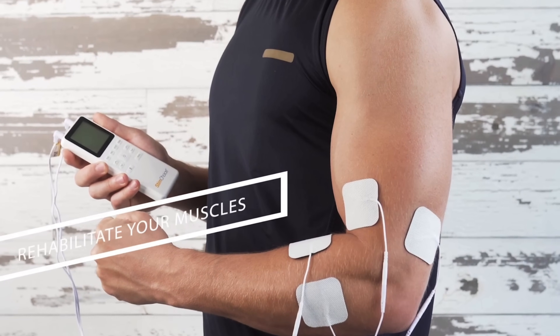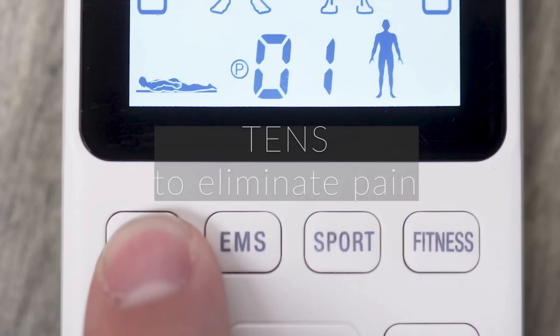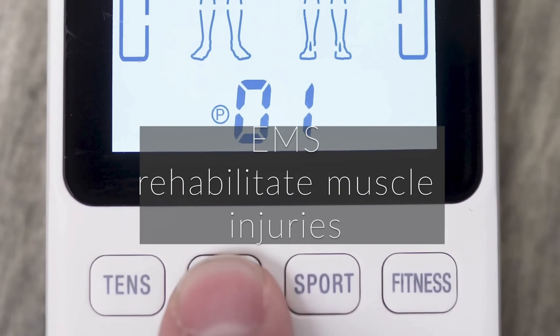Today we're going to talk about electrical stimulation, primarily TENS, EMS or NMES, and FES — what all these terms mean, how you should be using these different types of electrical stimulation, and whether or not you even should be using them to help you restore your movement and improve your function.